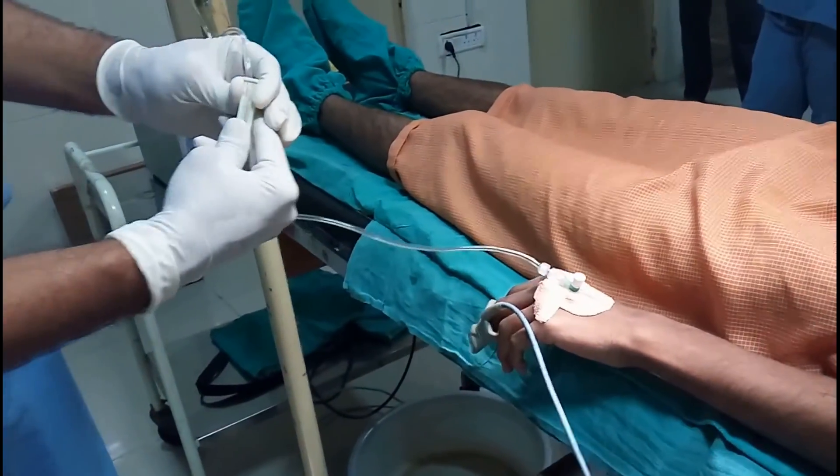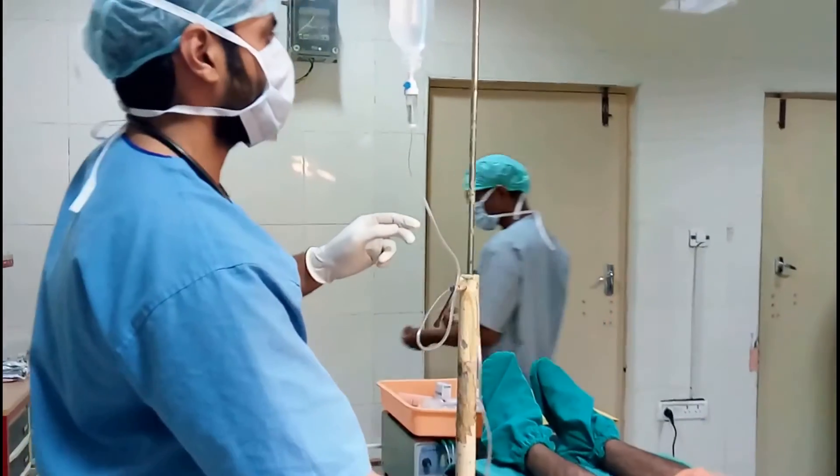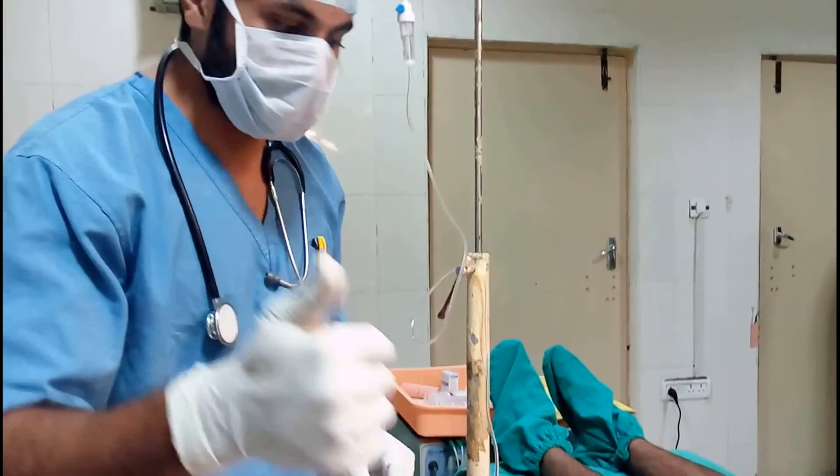Moment of truth — we have a flow. Thank you.